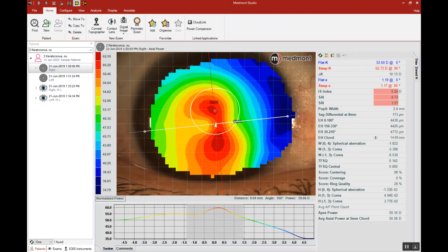Now let's look at another case. Here we have a keratoconic patient with an incredibly high central corneal astigmatism, a very steep cornea, with all the disease detection indices lit up in red. Now is this a prolate eye or an oblate eye? This eye is steepest in the center, flattest toward the periphery.